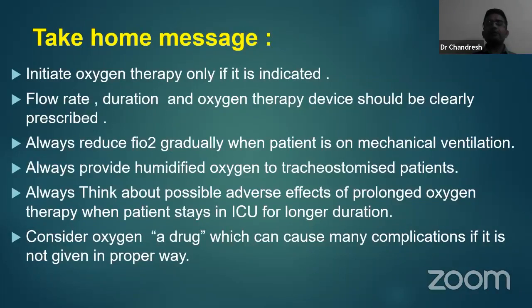So always remember, tracheostomized patients' humidification should be well maintained, because their air is bypassing the nose and oropharynx. So there is no natural humidification happening. And many times you might have seen that a patient who is requiring 1 or 2 liters of oxygen support also gets some humidification from the wall mount. It is not ideally required, because if a patient's oxygen requirement is only 1 or 2 liters, it means they are having their own natural humidification from the nasal cavity.